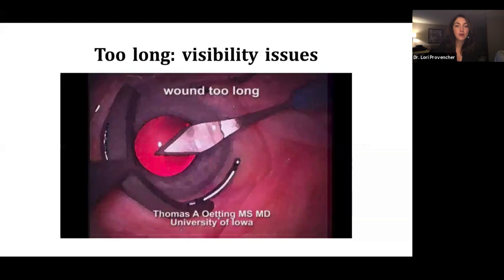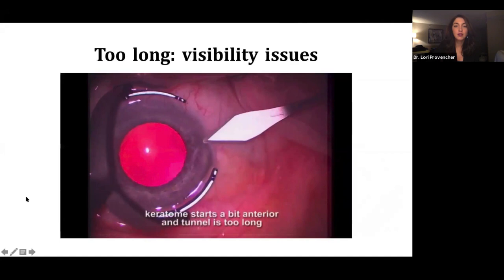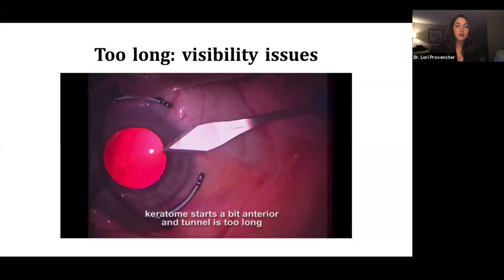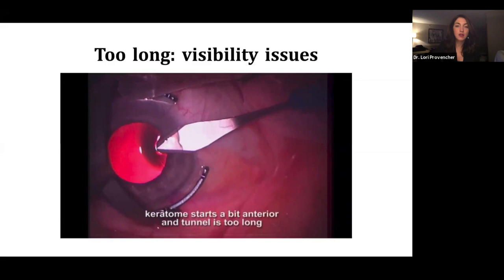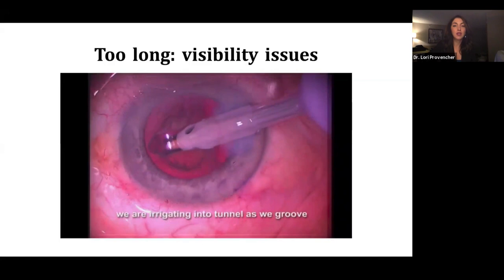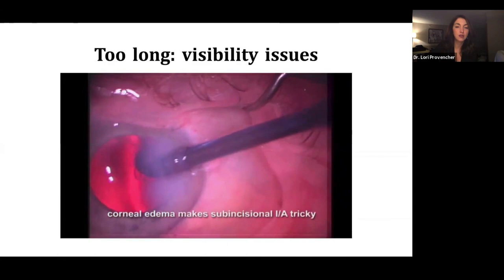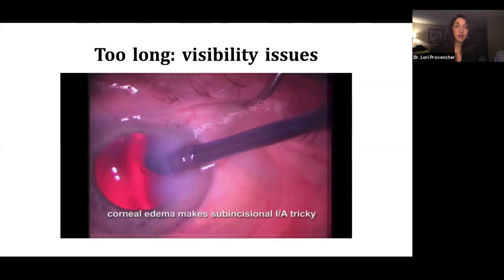Here's a video that Dr. Tom Oding was allowing me to use, and this is a nice example of what happens when your wound is too long. So you see here they're entering a little anterior. And then as they go forward, the tunnel is a little too long. They end up with this rather long wound that is paracentral cornea when it ends. And as they're doing nuclear disassembly and cortex removal, you see how much hydration of the cornea you get, and it really affects your view. So if this happens to a degree, you either need to recognize it early and be quick with your case, or go ahead and make a new wound altogether.